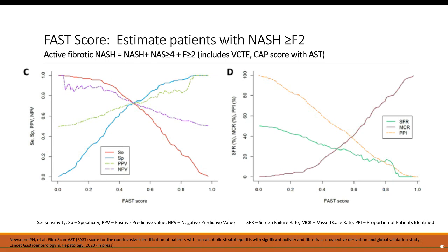The problem with that is, in the setting of fatty liver, as you progress to cirrhosis, you begin to lose the fat in your liver, such that in fact a third of patients that have cirrhosis due to NASH, there's no fat left in the liver. We call that quote-unquote cryptogenic cirrhosis. If we transplant those people, the vast majority of them will have fatty liver in 6 months following their liver transplant. I still stand by my answer. No, I don't think FibroScan can distinguish Hep C cirrhosis from NAFLD cirrhosis.